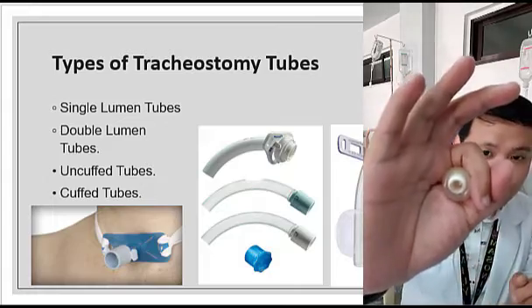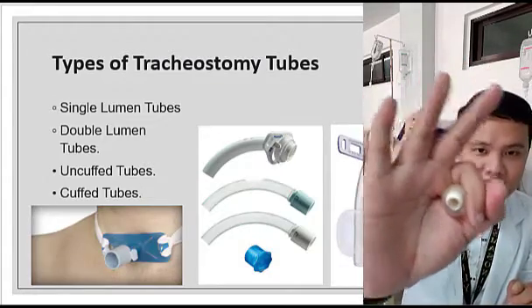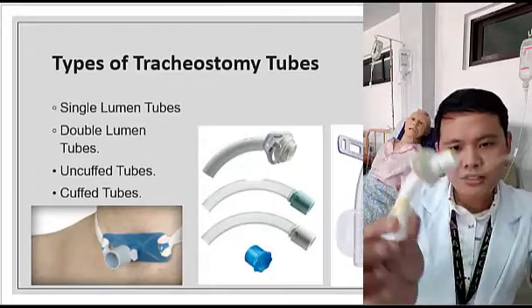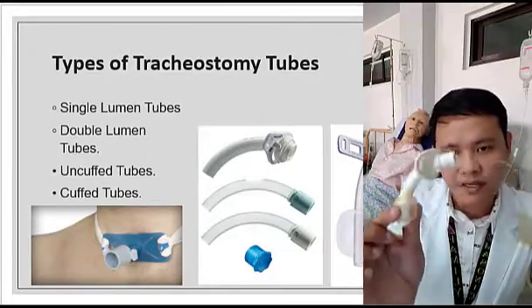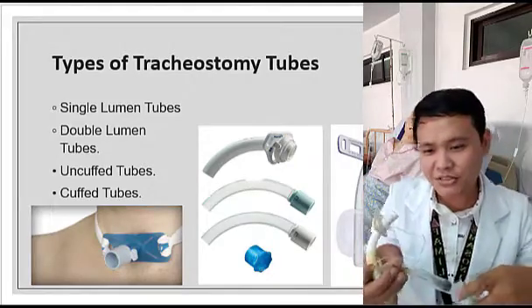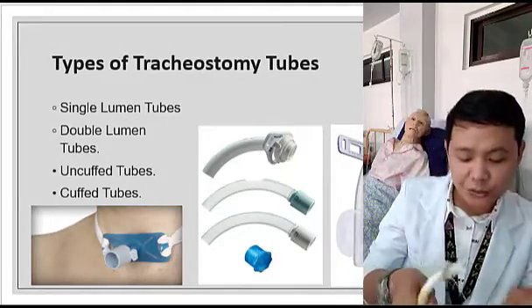So nakasecure po siya. Okay? Mas secured yung tracheo. So if you're ready to pull it out or remove this one, okay, de-deflate mo lang din siya. Okay? That's it. So that is the cuff tubes.